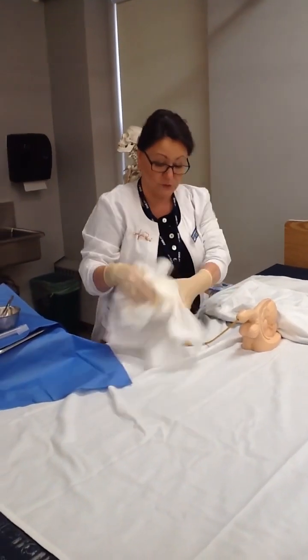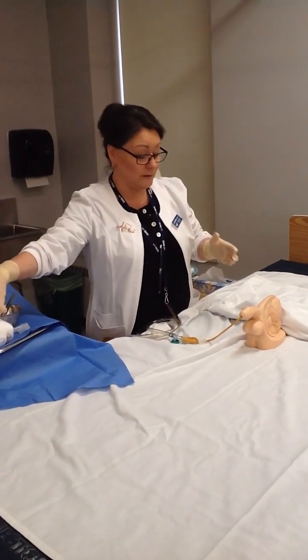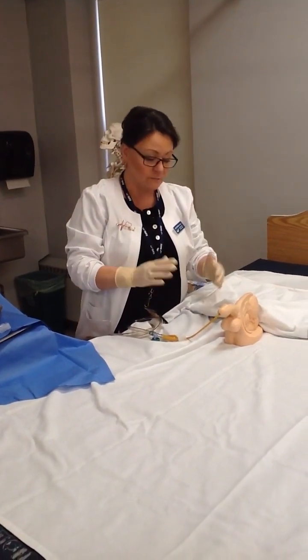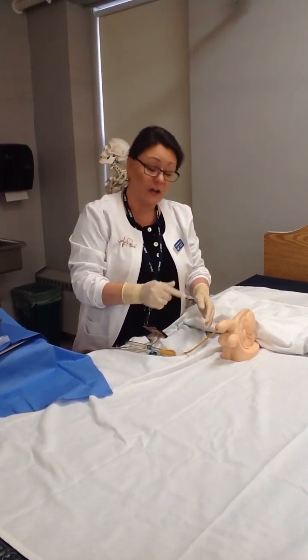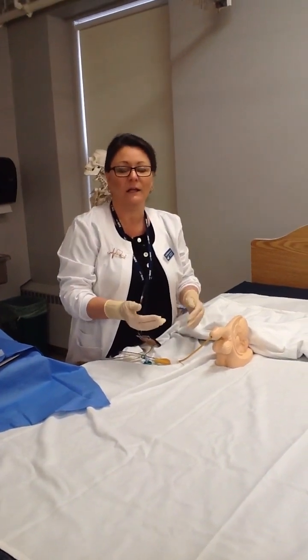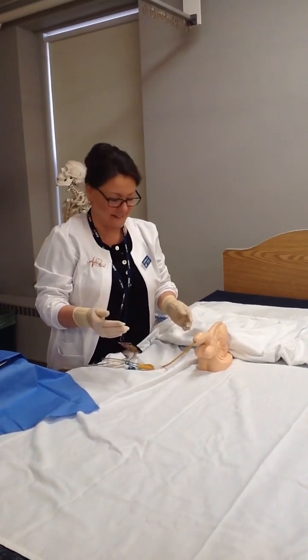I'm going to get some soap and water, and I'm going to help clean up my patient and make sure I've cleaned all of that cleansing solution, make sure that there's no wetness there. I would have also added a disposable pad under my patient's hips as well, which I missed this time in this video, but I would have put that there.